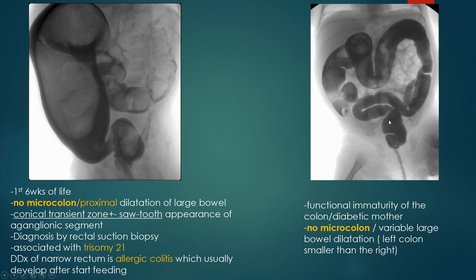In the case of meconium plug, the colon is dilated and contains fecal matter appearing as filling defects. There is no transition zone and the rectosigmoid ratio is preserved — we can see how the rectum is dilated compared with the sigmoid. The contrast enema is usually therapeutic in these cases.